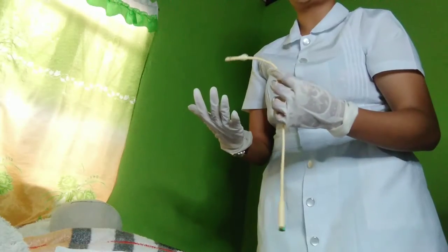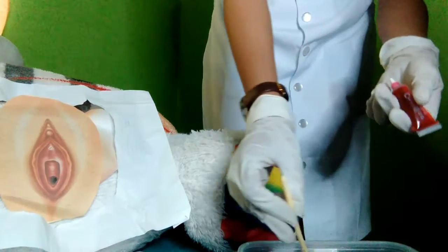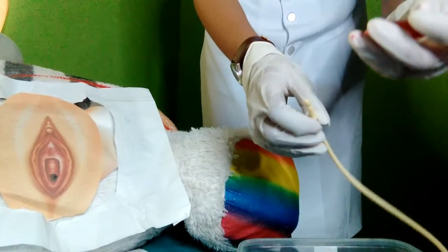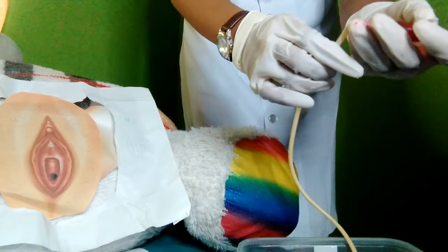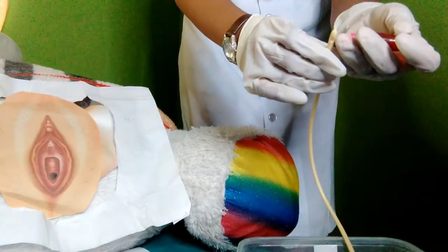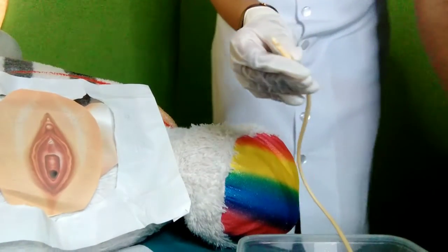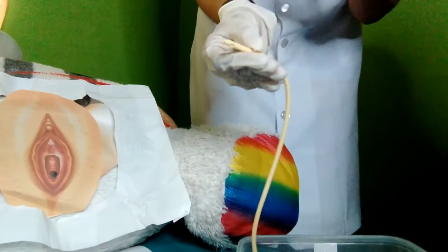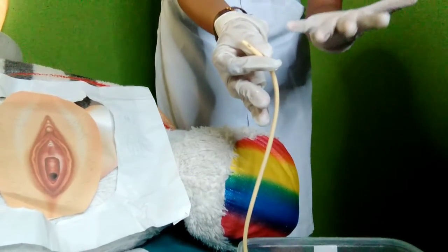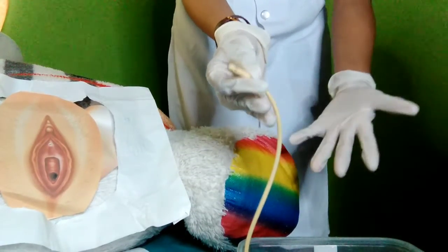So let's start. Lubricate the tip of the catheter using the sterile lubricant included in the tray, or add lubricant using the sterile technique. The lubrication minimizes urethral trauma and discomfort during the procedure.